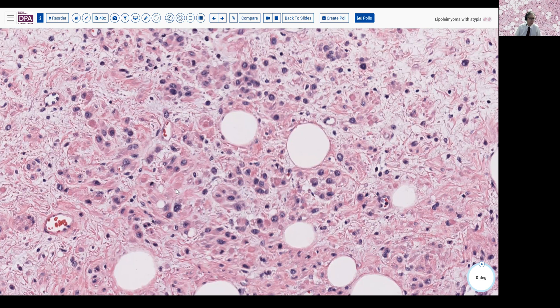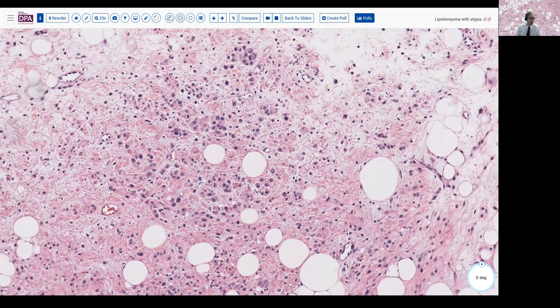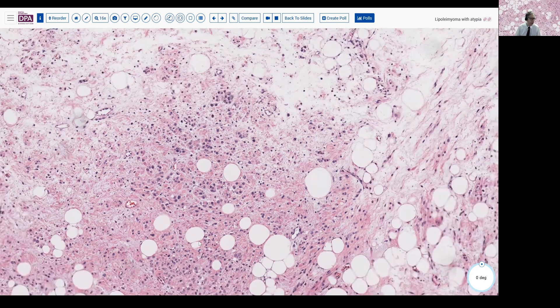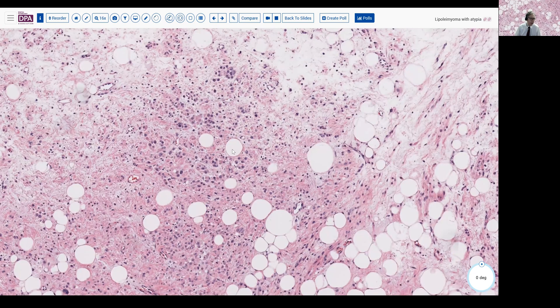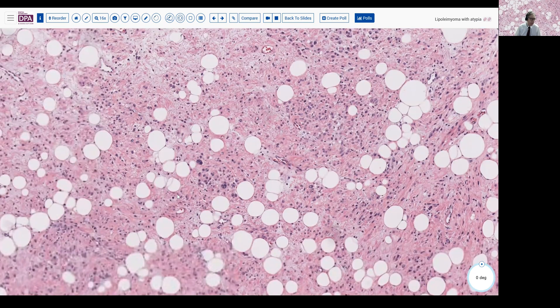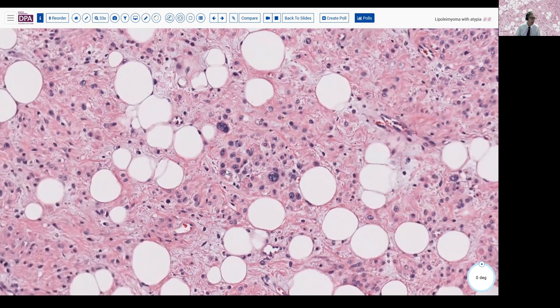Immunohistochemical stains were conducted that demonstrated these to be nicely positive with Desmin and other smooth muscle markers, and negative for HMB-45 or other markers of PEComa. Also performed was a careful mitotic count. In light of the atypia, there was some concern for smooth muscle malignancy.